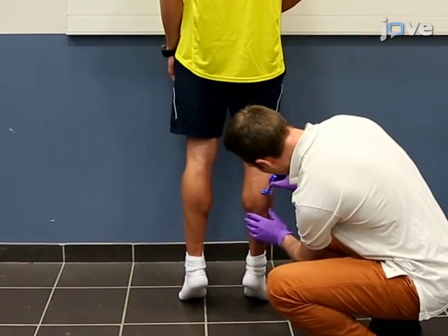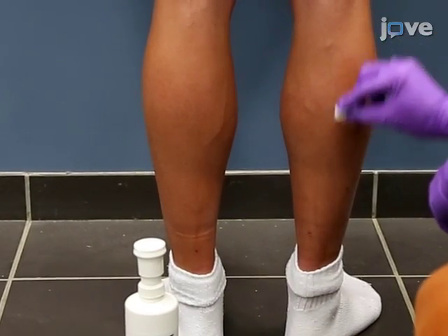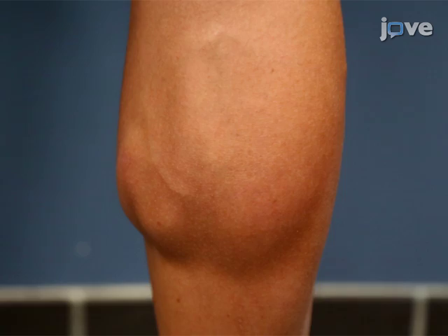Clean the skin where the electrodes will be placed by shaving off the hair and scrubbing the exposed skin with alcohol. This is required for a low impedance connection.